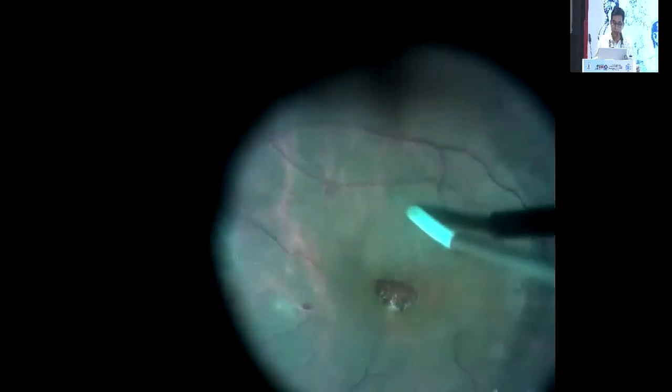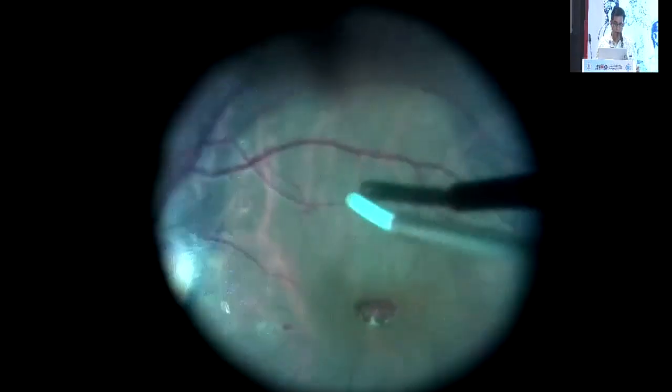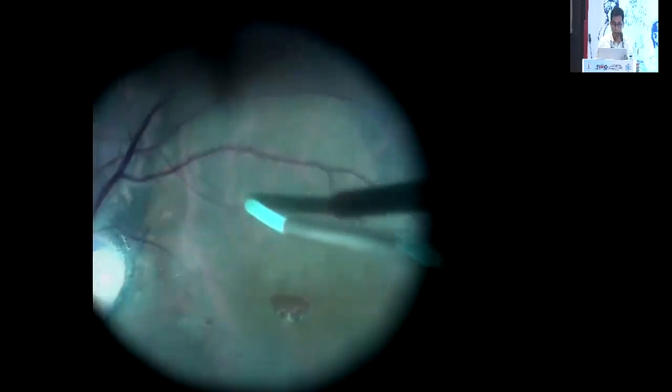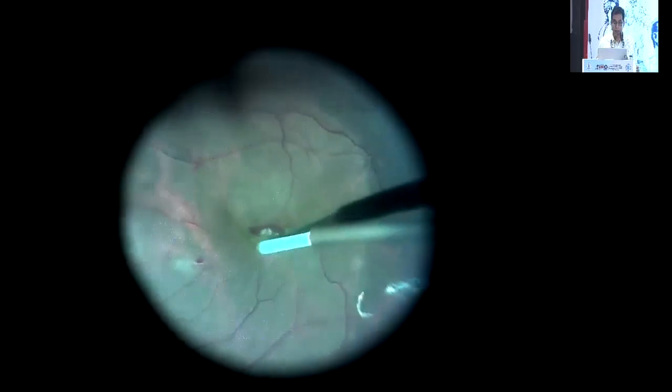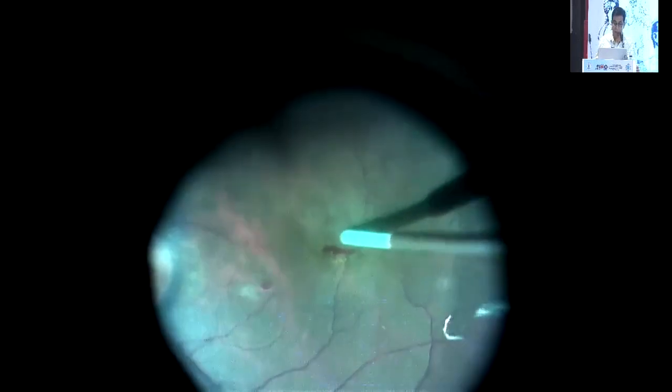Once this is done, take your silicone-tipped cannula and just massage the retina. There have been lots of reports of inducing a retinal detachment to make the retina compliant. One would be surprised to see how compliant the retina actually is. You can really massage the retina and make the hole turn into a small slit. You have to be gentle. It really doesn't cause any bleeding or anything of that sort, and I haven't had any tears for long. Many of us are using this.